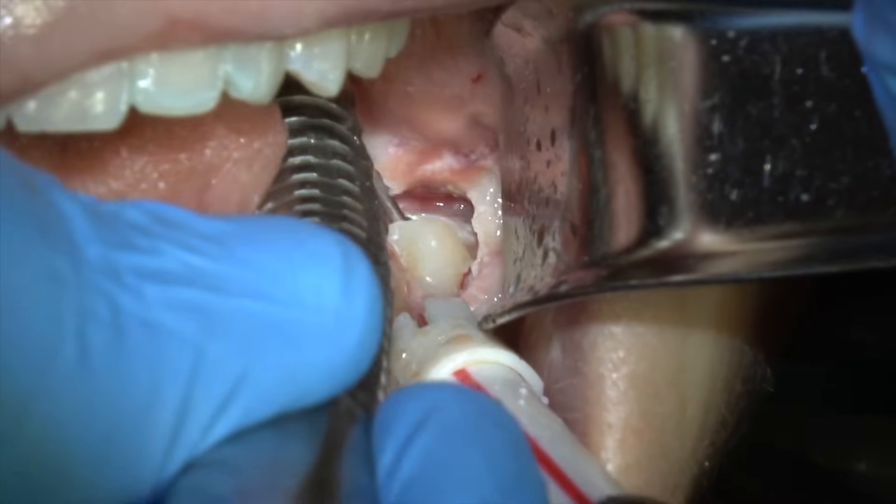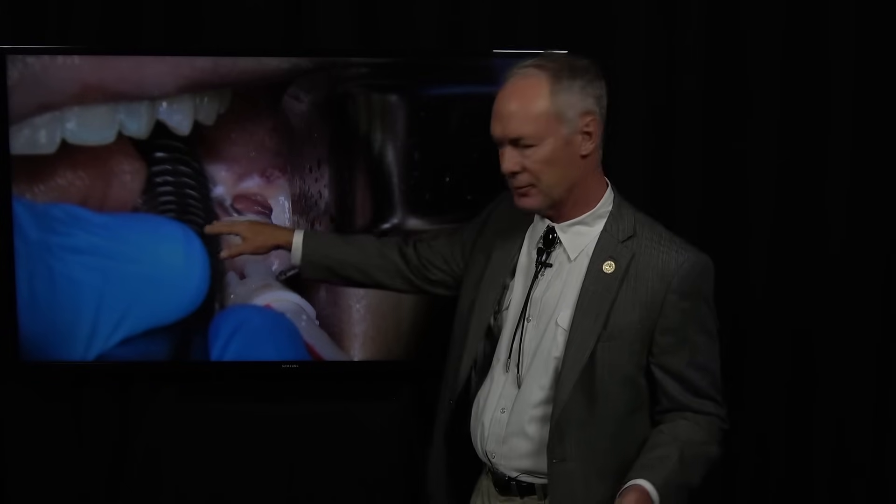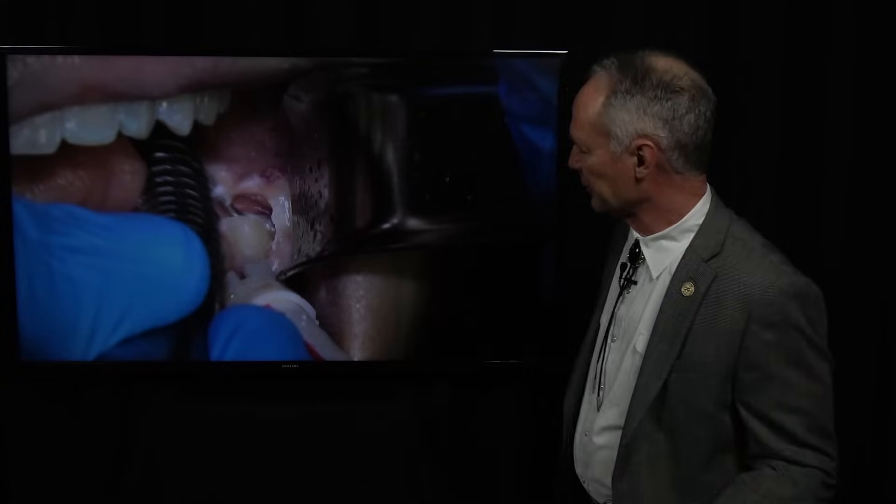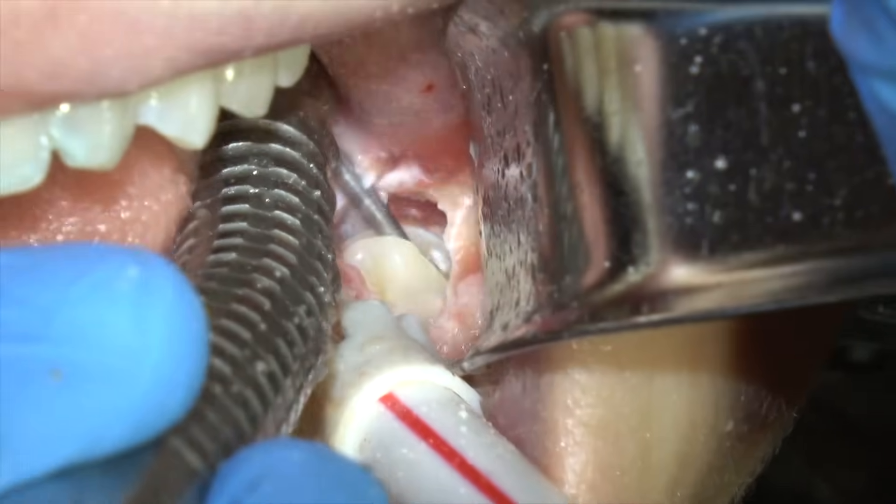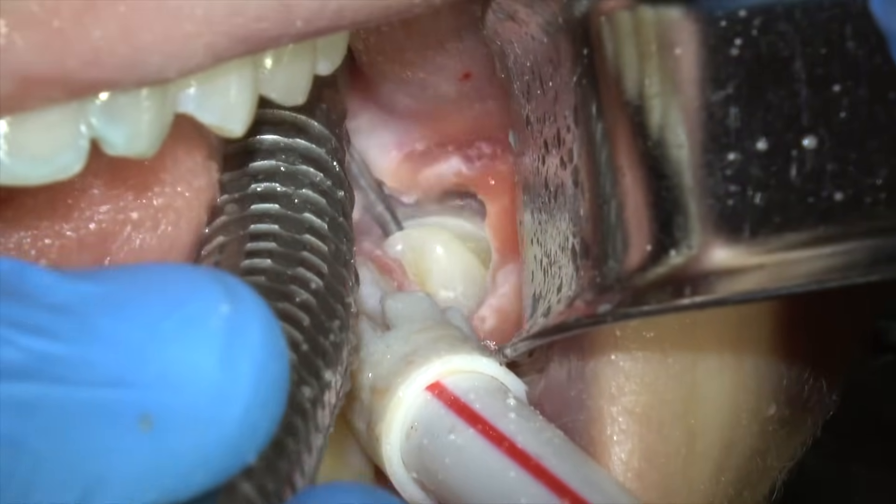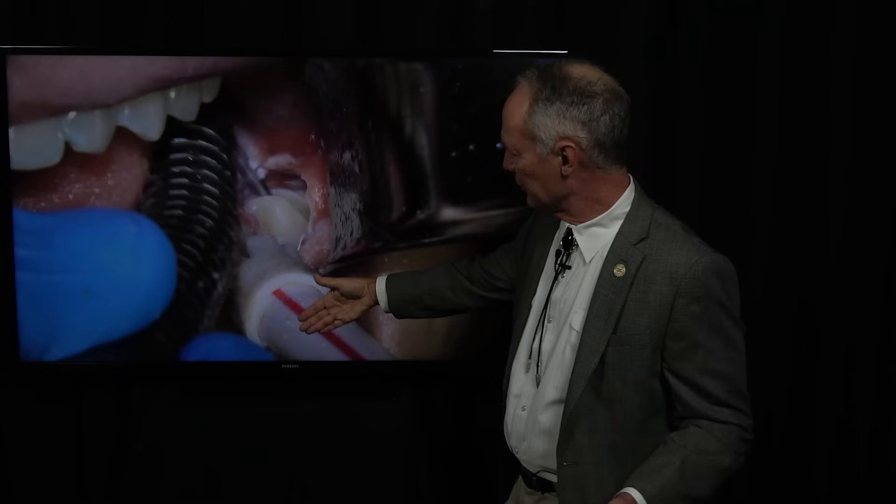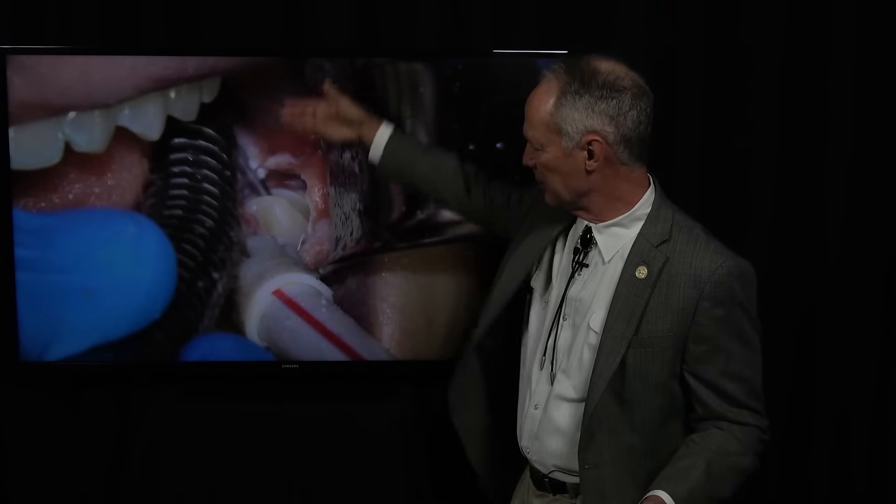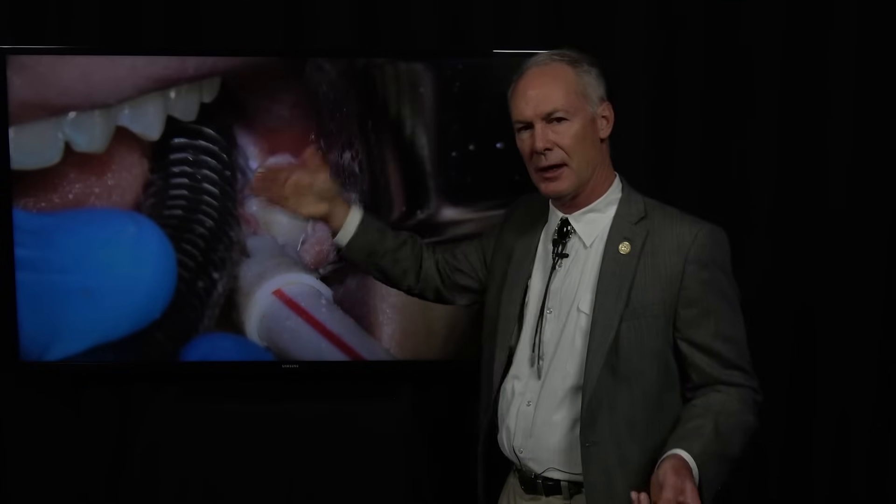And what I'll do is cut both the bone and the tooth. So you've got an area to elevate the distal aspect of the tooth into when you separate it with your burr in just a minute. Now I'm cutting through the tooth. And you want to cut all the way to the furcation, all the way to the furcation.